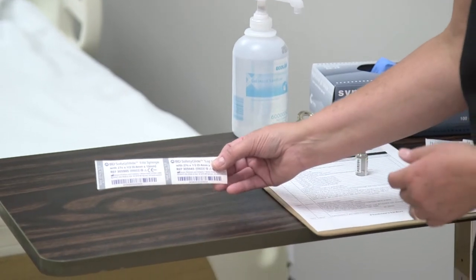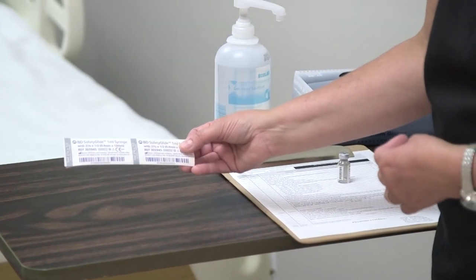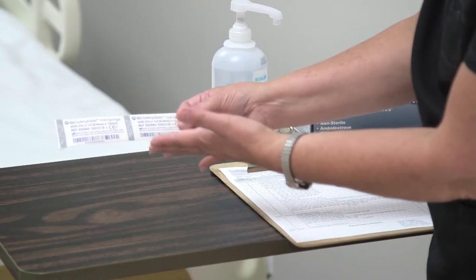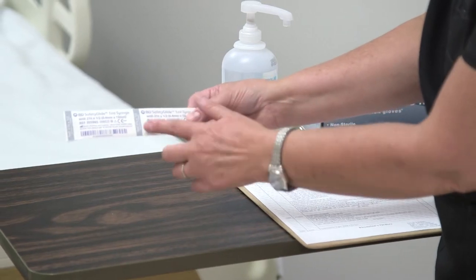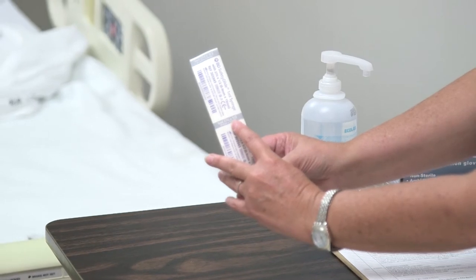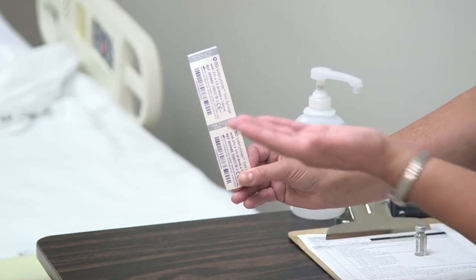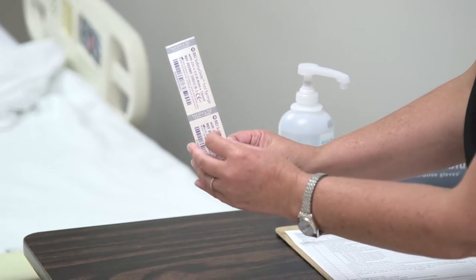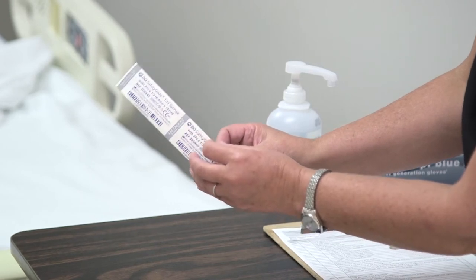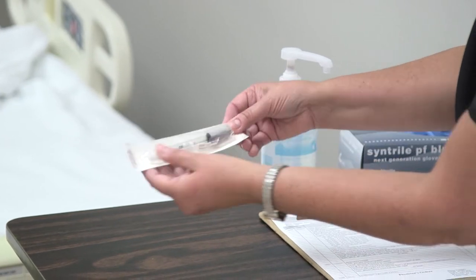We're going to demonstrate how to draw up and inject an intradermal medication. This is a tuberculin syringe, typically one milliliter in volume with a 27-gauge needle. Because we're giving a very small amount just under the epidermis, we don't need a large gauge or a long needle. This one is a half-inch needle, which is pretty standard.